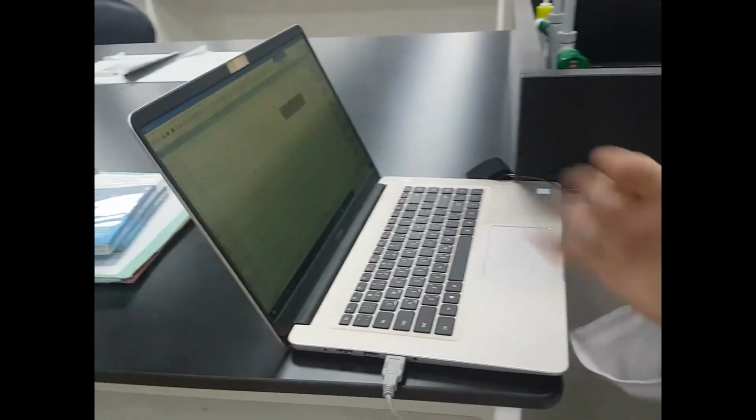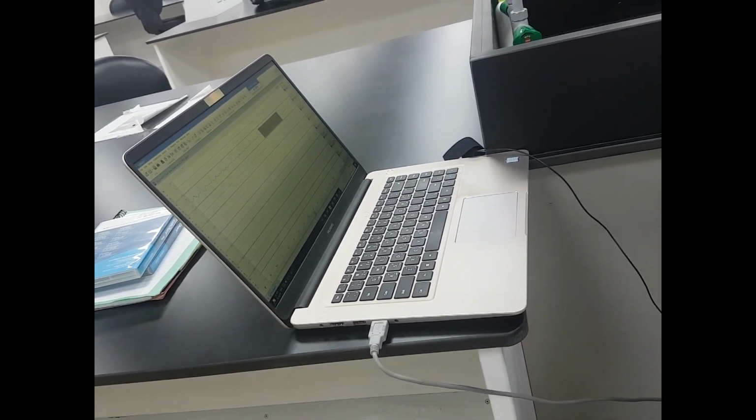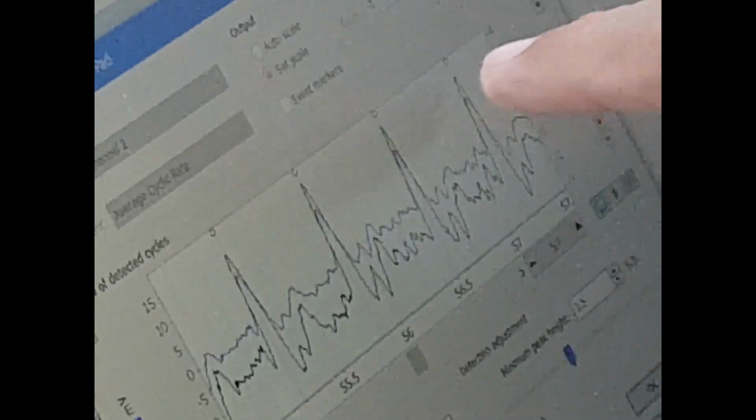We do not calculate heart rate variability from the pulse. This is not the standard thing. The standard thing is to take an ECG recording, because this pulse does not have a sharp peak. See, if you go back to datapad and go to options, the program is just marking the beats. You can see these small circles on every beat. So it may be different by some milliseconds if we compare it with the ECG. Now our next job is to record ECG.